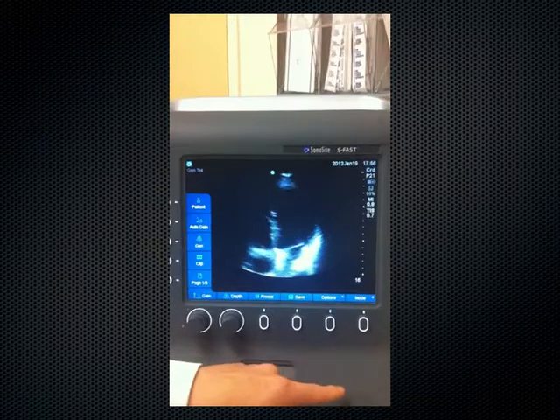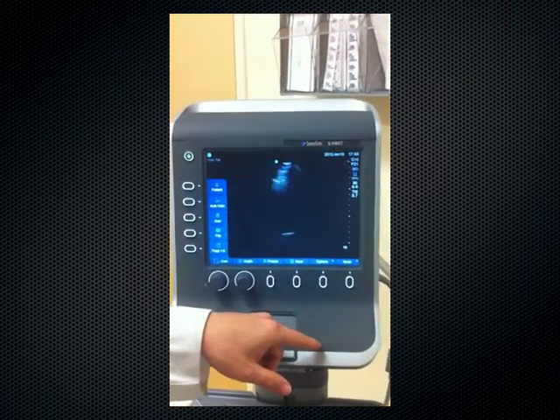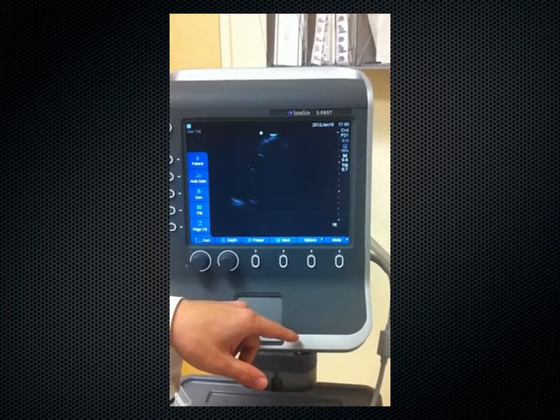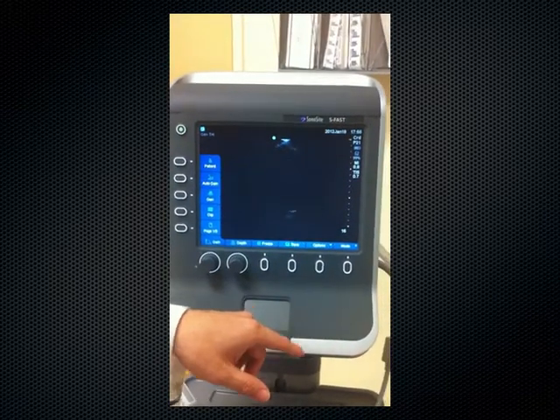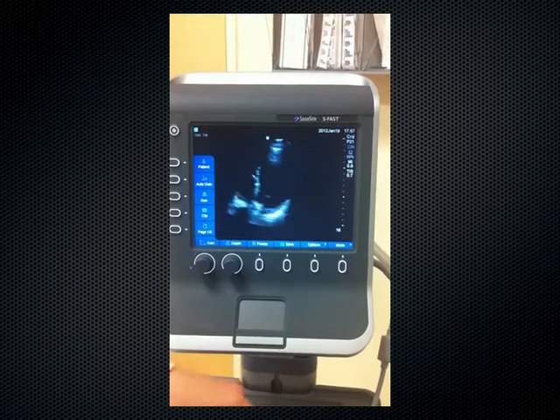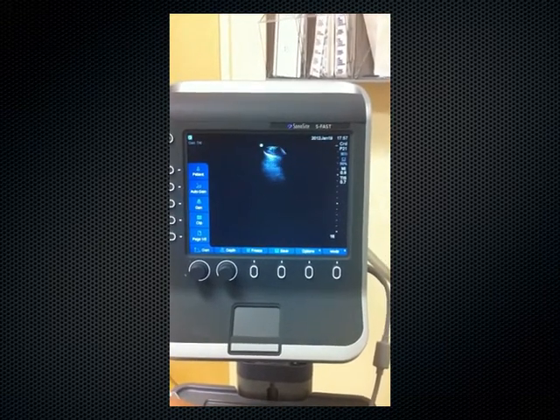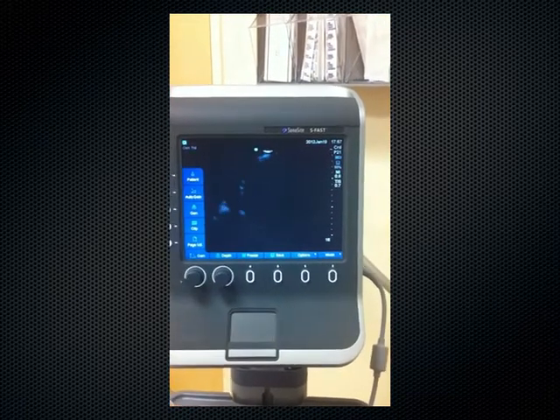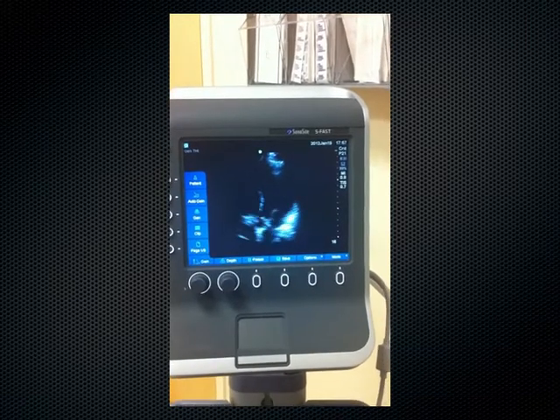Next, we're going to do a fifth chamber view of the heart. Let's see. Almost there. There. Yeah. Perfect. Okay.